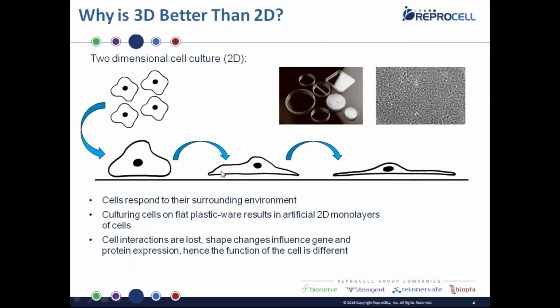And it is going to do that more and more through feedback system to the nucleus, so you have more gene expression, more protein production, and you get more and more adhesion of the cell, up to the point where you end up with a very flat cell, which is quite different from the morphology it would have in vivo. Here you can see this is a bright field image, and you can see a lot of little nuclei. So from the top it looks quite similar to what we had in vivo, but if you were to look on a side view you would see that the cell is actually very flattened.